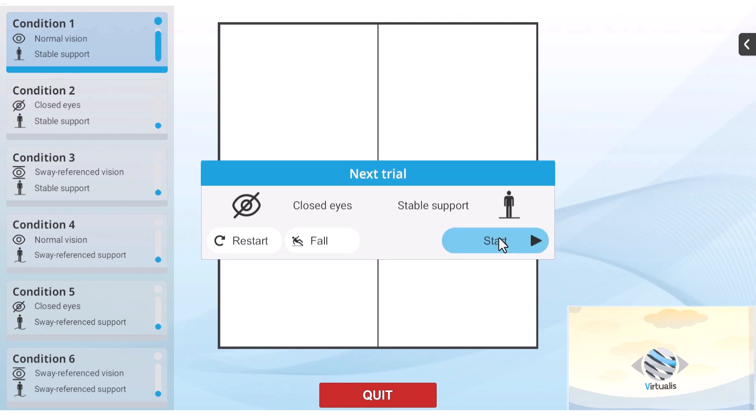At the end of each trial, a window will appear giving the clinician the opportunity to indicate a fall, restart the assessment, or move on to the next condition.